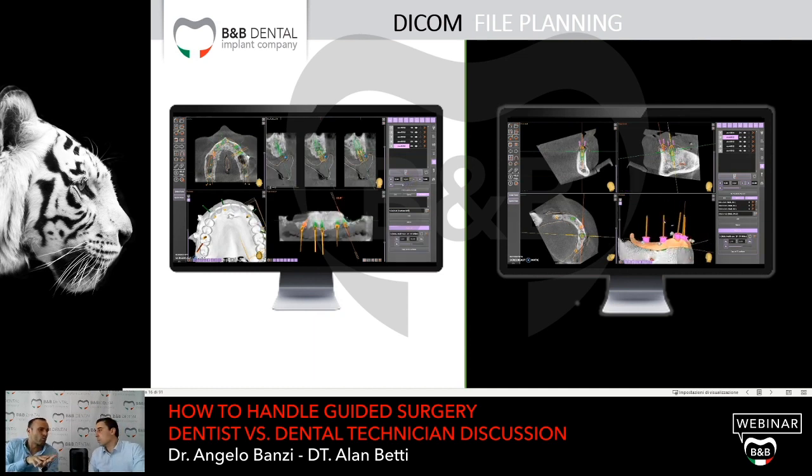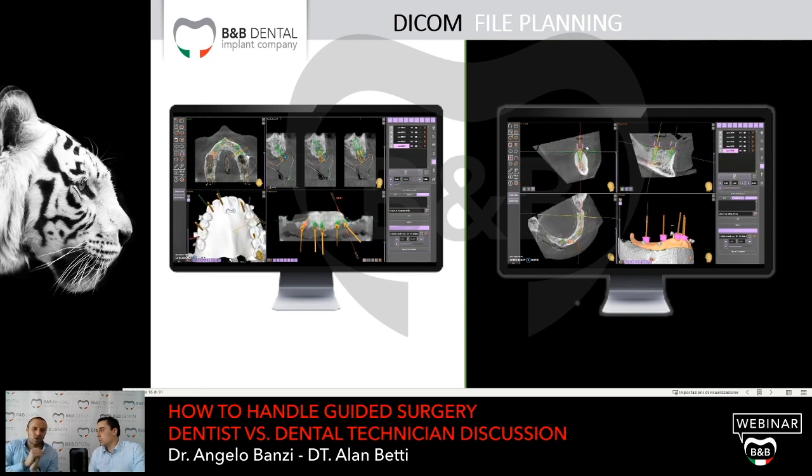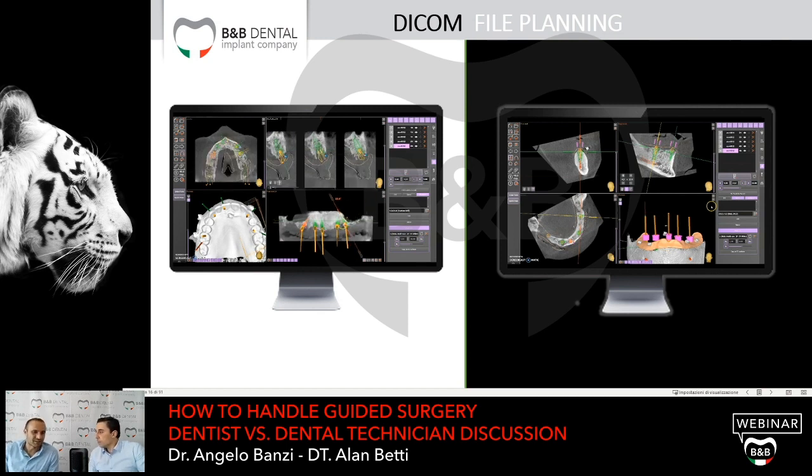Well, what do I have to do? Because five years ago, when I started working, the only option that I had was opening a flap. Most of the time I try to avoid opening any flap, because I want to give my patient a better post-operative situation and healing, and it's good when you don't open any flap. So, do I have to open a flap?